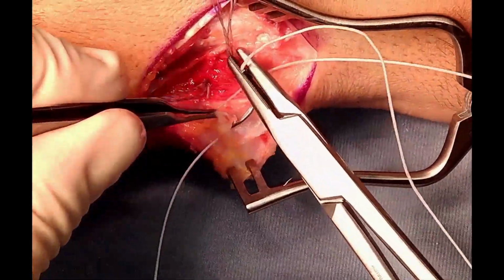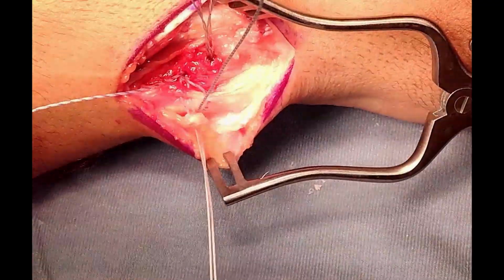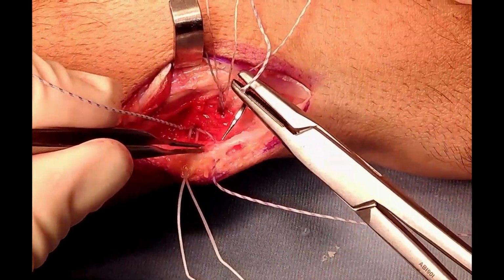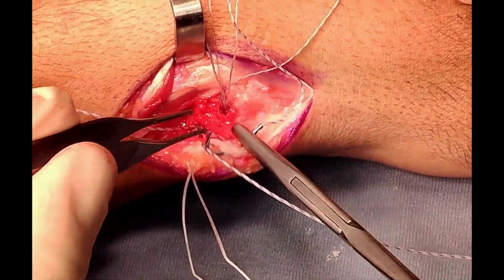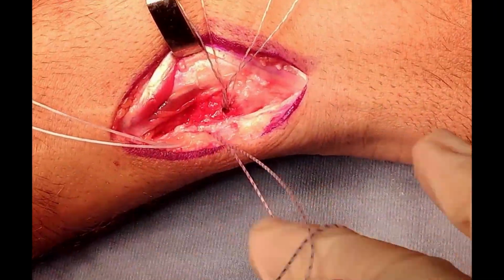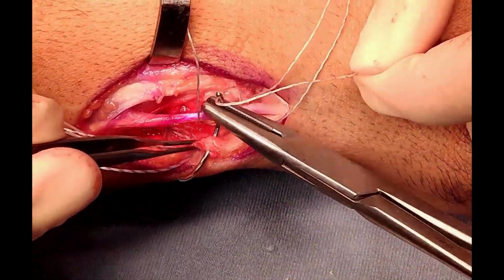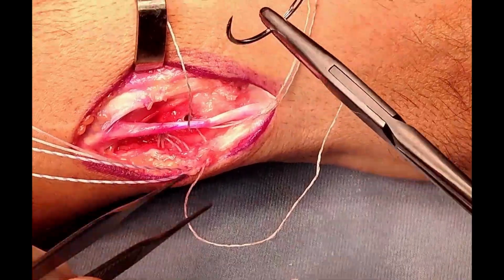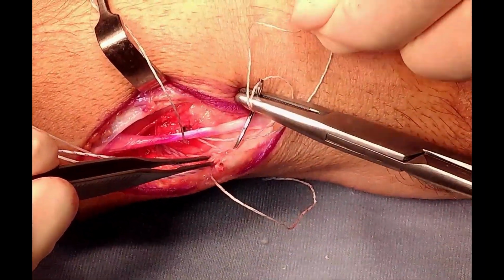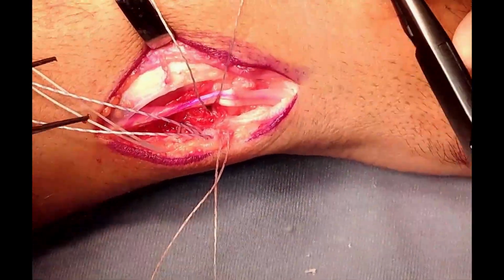We will start working on the proximal part. As we can see, every strand goes inside the subsheath and then the extensor retinaculum. So the retinaculum will be used and utilized to give the stability of the ECU using these sutures and 2 anchors. Now we could also put a groove or deepen the groove for the ECU, but I think this is redundant, and the way we used here is using the soft tissue with the help of the anchors as stabilizers.